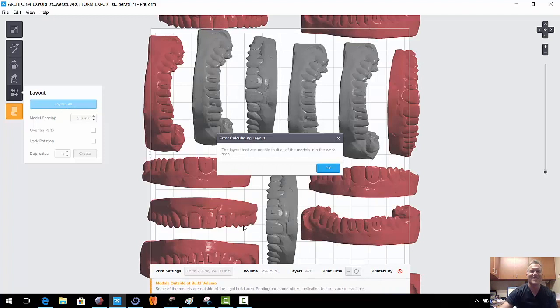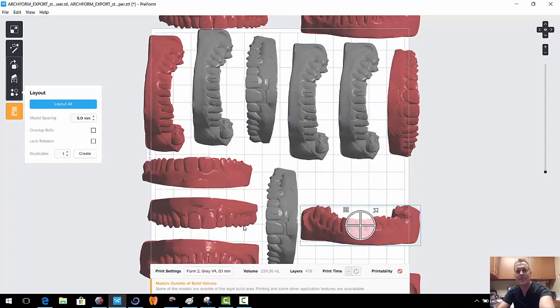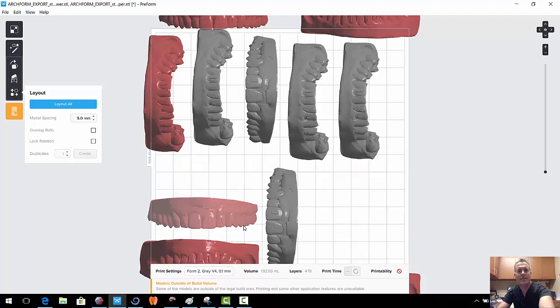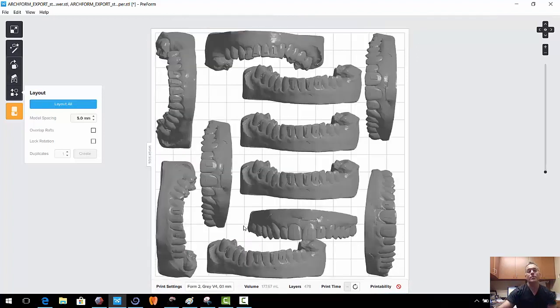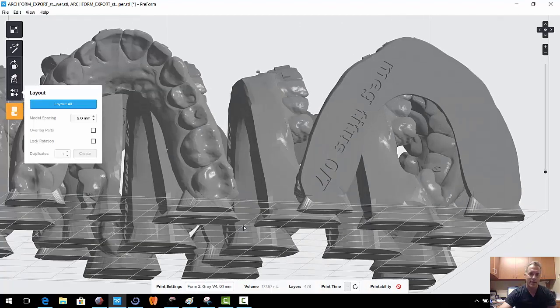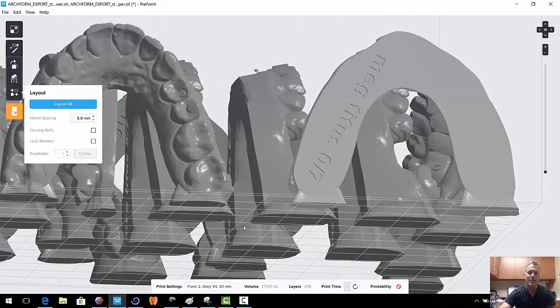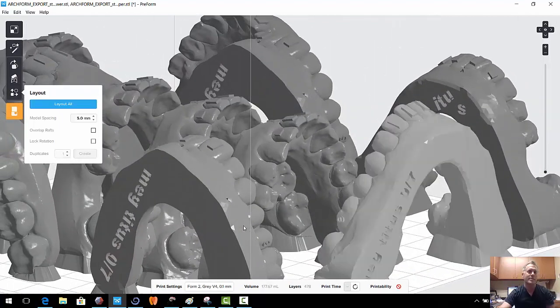So let's be a little bit more reasonable and get rid of a few of these and hit layout all again and see what we get. Yeah, so it arranged quite a few models. We have 2, 4, 6, 8, 10, 11 vertical models on the Form 2. You can see that it tells you the patient's name and the aligner number on the bottom of the model, which is a really cool function as well. We would just print these out and do a pressure form.